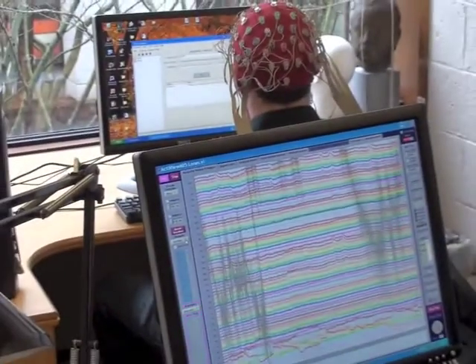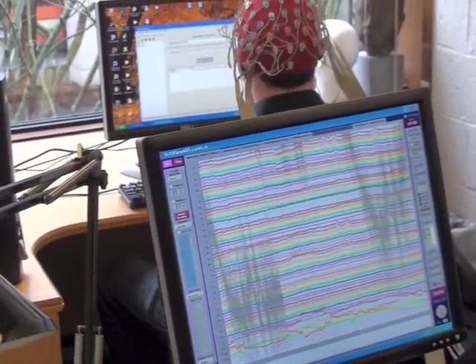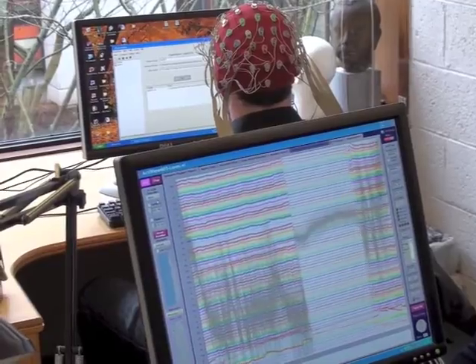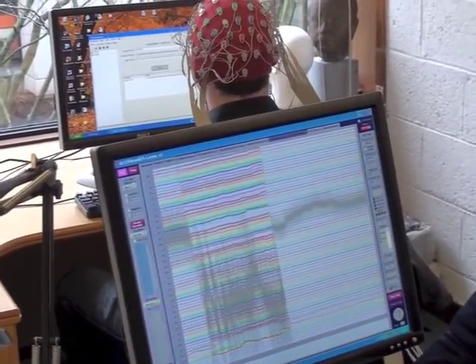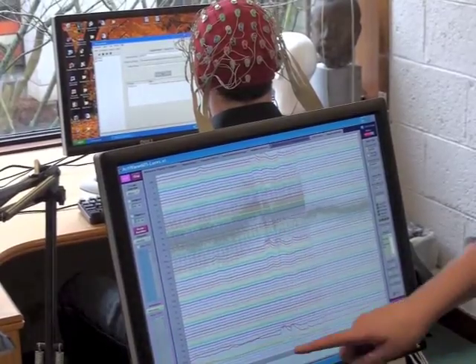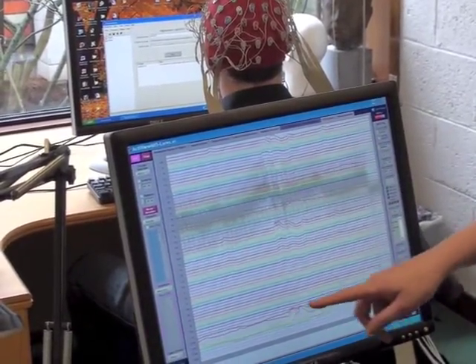Okay. Now I might just do this at a higher scale. I think we might be having electrical interference. Bren, will you blink for a sec? You can see when that's registering as a blink.